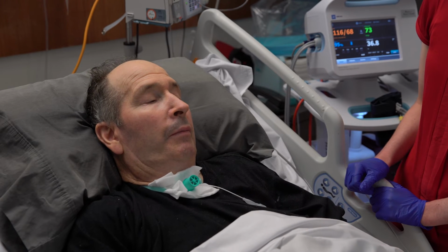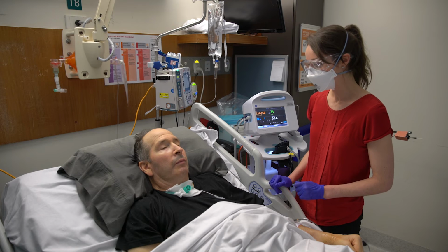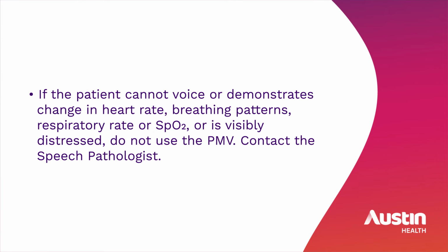Ensure the patient is comfortable and able to voice. Let's hear your voice, Colin. It's good. Excellent. If the patient cannot voice or demonstrates changes in heart rate, breathing patterns, respiratory rate, or SpO2, or is visibly distressed, do not use the PMV.